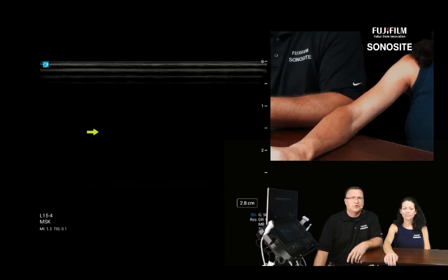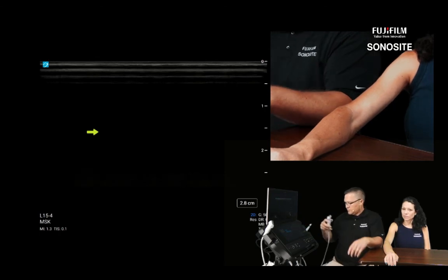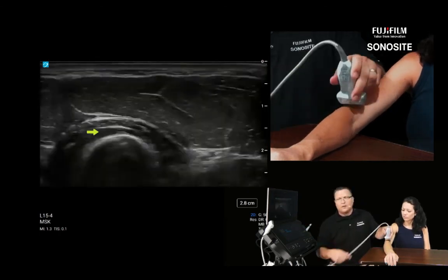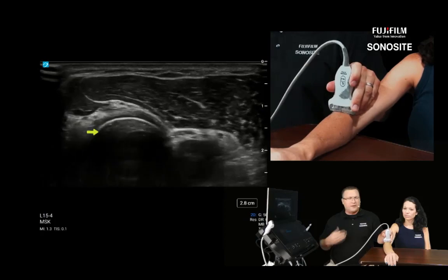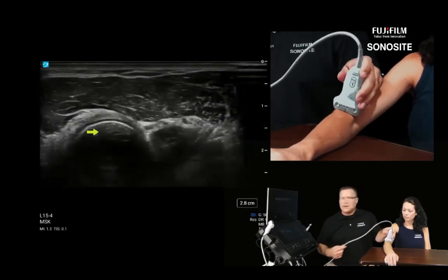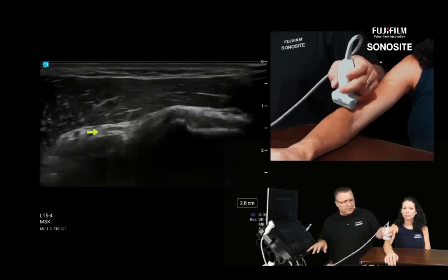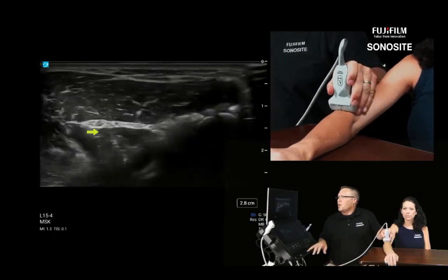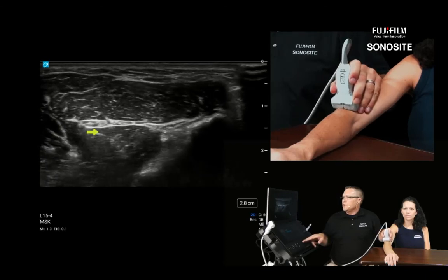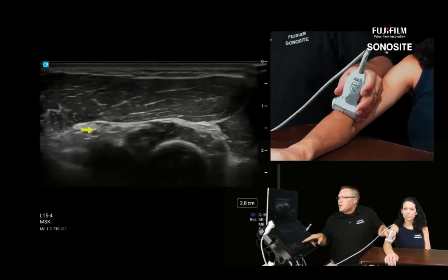Sure. So the posterior interosseous nerve through the supinator full section. You bet. So radial head, neck, tuberosity level will start to show me where I should expect to see the supinator. Let me flip the probe because that's how the PowerPoint presentation was. So here's the radial nerve, and let's follow that radial nerve. Let's follow it distally, distally, distally, slightly more anteriorly.